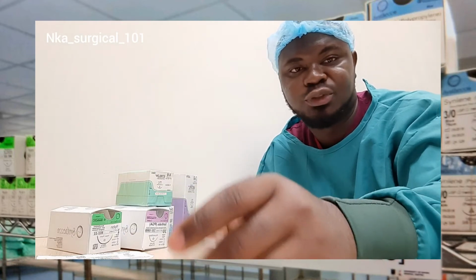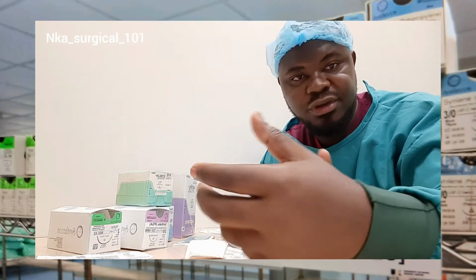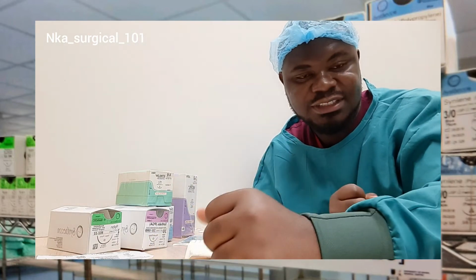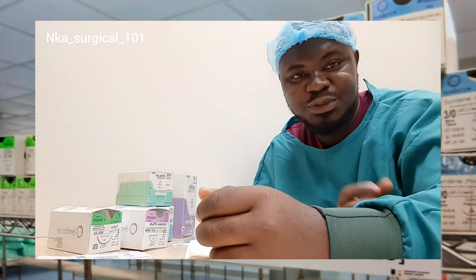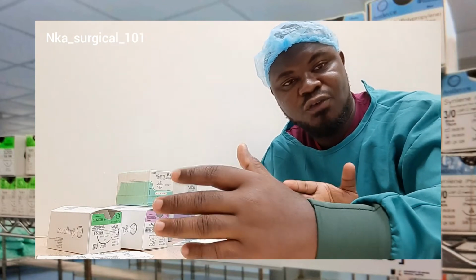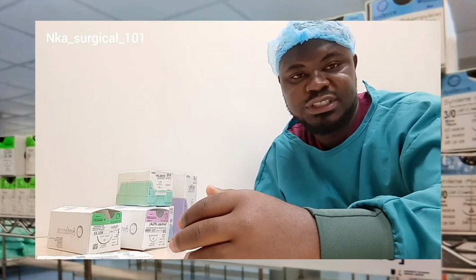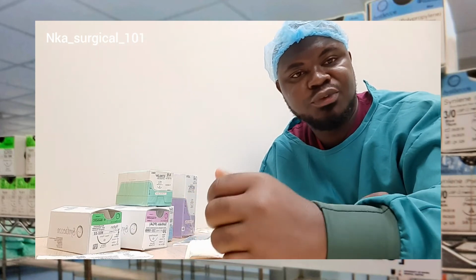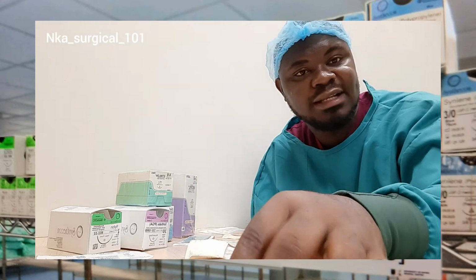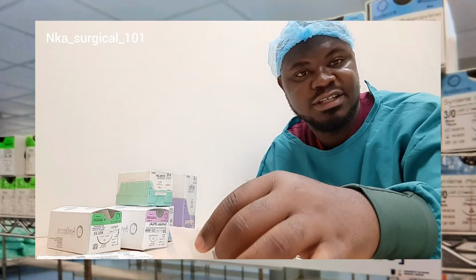So on a review, we have absorbable sutures, and under absorbable sutures we have the synthetic and then we have the natural sutures. Under the synthetic sutures we have the vicryls, the monocryls, and the PDS. They all fall under the synthetic absorbable sutures. And with the natural absorbable sutures, we have the guts. An example is the chromic cat gut and then the plain cat gut. They all fall under the natural absorbable sutures.